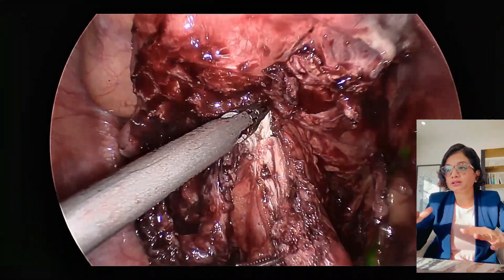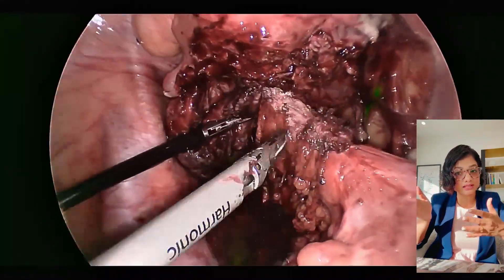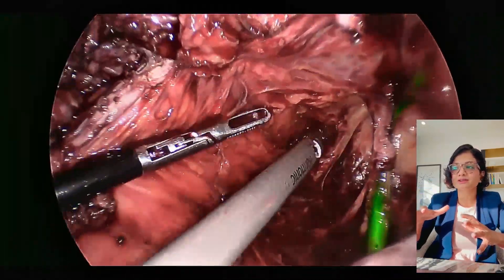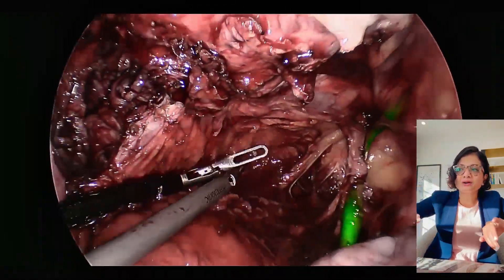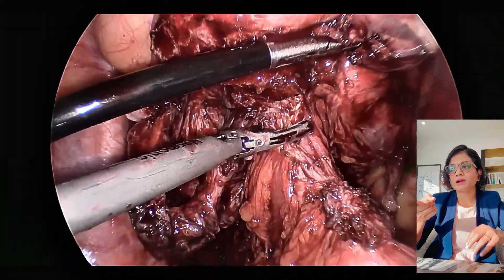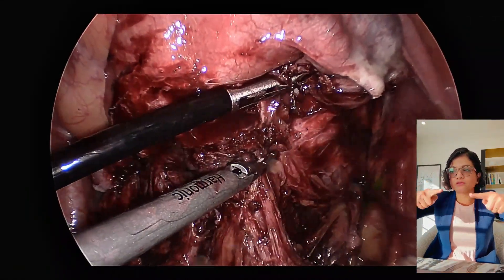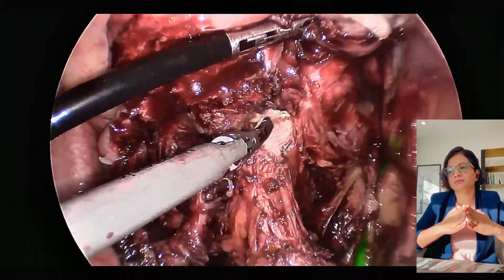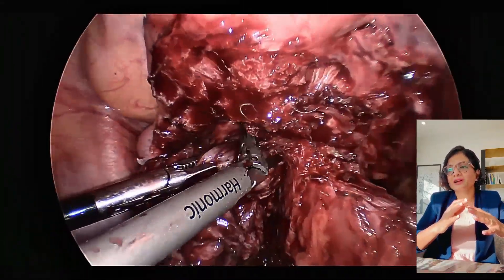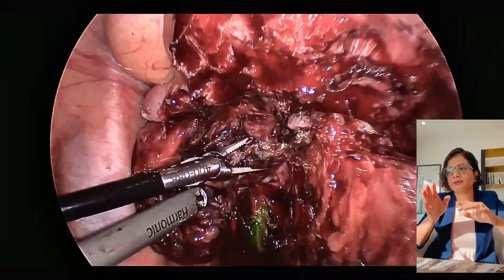That nodule is out, but there's no give. Usually once you're through one particular nodule it just opens up easily, but not in this case. Like I mentioned, three to four centimeters of bowel just plastered to the back of the uterus. I'm not giving up — I still want to find that rectovaginal space. A really good action by my assistant: she's pulled the rectum back, which narrows and creates that inverted V shape, helping me figure out where exactly I need to make that cut. I'm trying to lateralize whatever structures are stuck so we just isolate only the rectal nodule.